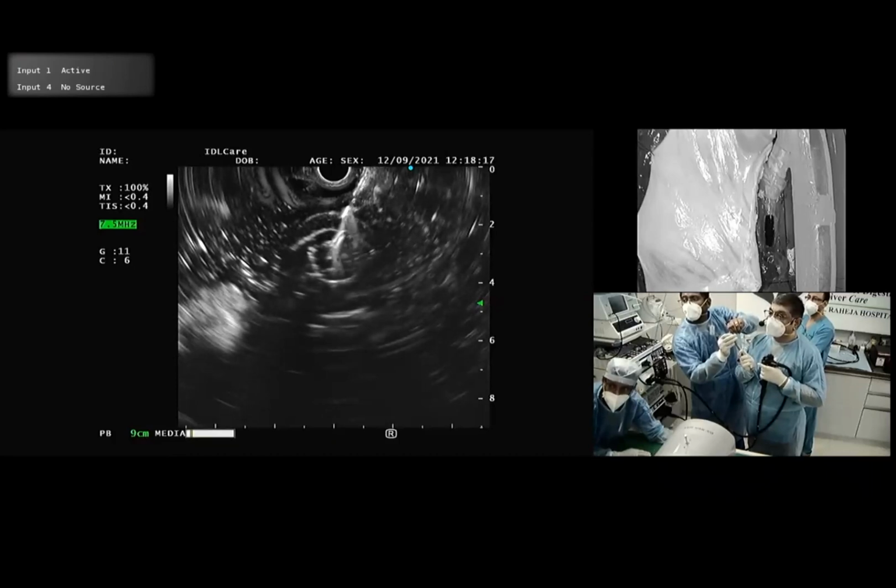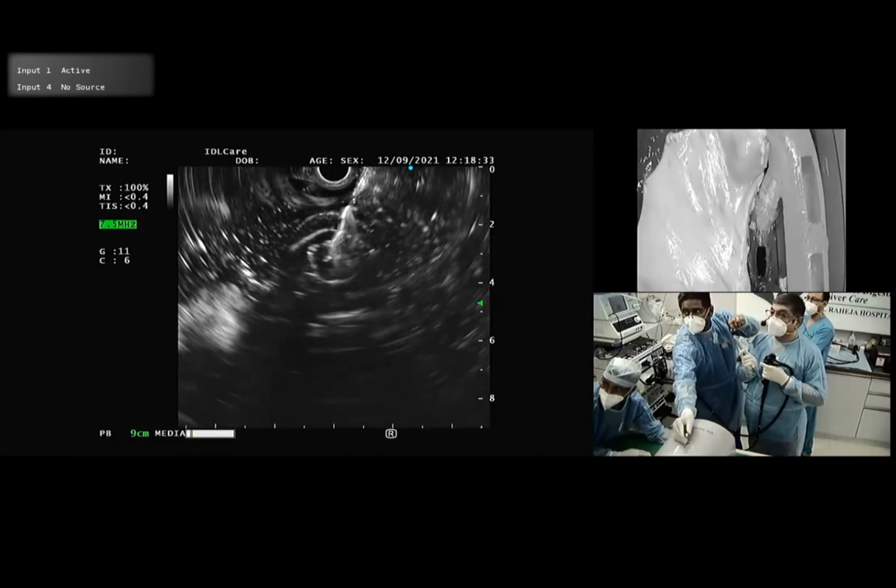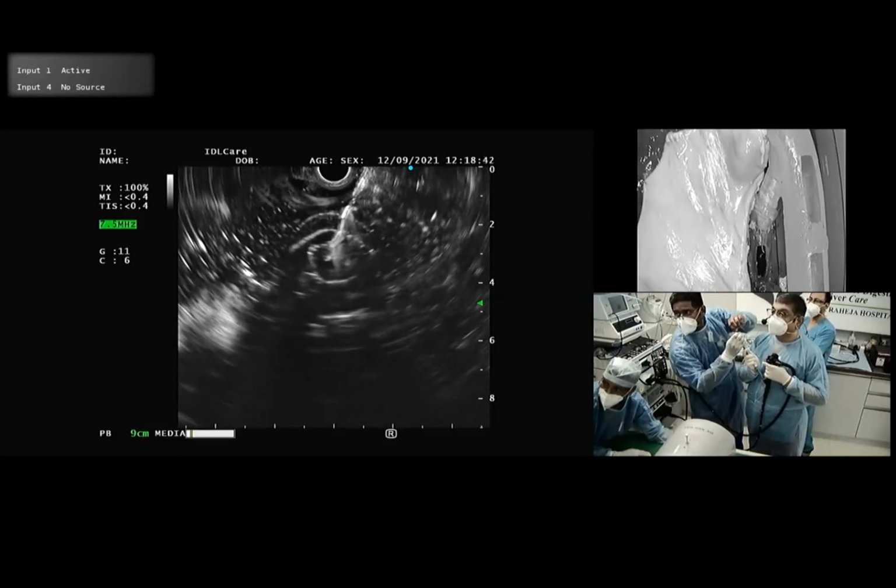So you have to rotate gently there. And there is a narrowing there at the papilla. So to go through the papilla is a big challenge. So we are trying to rotate, put it inside. Bibin is rotating the wire. Because it is a Terumo wire, it is not very visible to him. So he doesn't know which direction it is taking. So maybe a fluoro, a different wire, something needs to be done to improve the visualization.